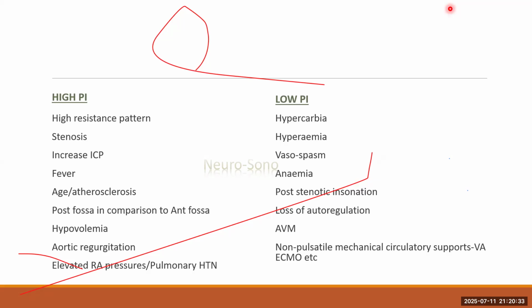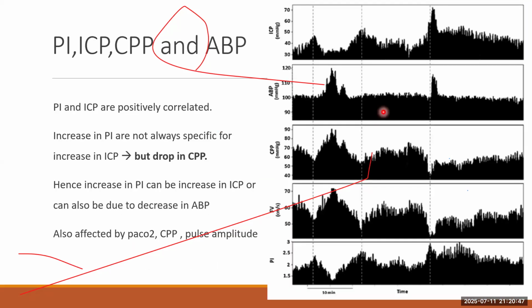Yes. So Dr. Mohan summarized it beautifully, and the most important point which he highlighted is the systemic hemodynamics. Whatever images we interpret have to always be taken into account with the systemic hemodynamics, respected and valued for their numbers also.